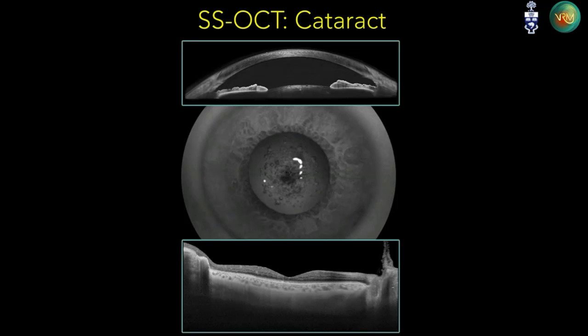So, that's post-op day 1. All of us who are operating on these patients know that the biggest morbidity is positioning and face down. If we can look at them post-op day 1 and change our paradigm, that will be pretty significant. If we can be confident about the hole status, which we haven't really been able to do consistently with spectral domain, that will be a big advantage. This is another example of a patient with an anterior subcapsular cataract, and you can see very clearly the retina was imaged pretty much with no problem.